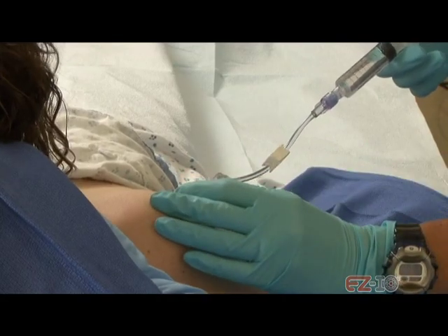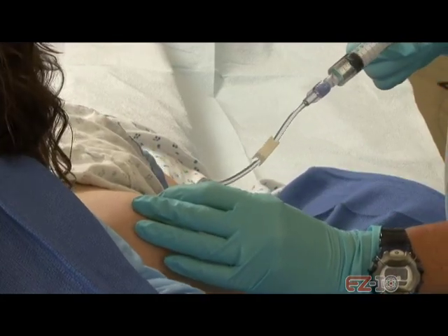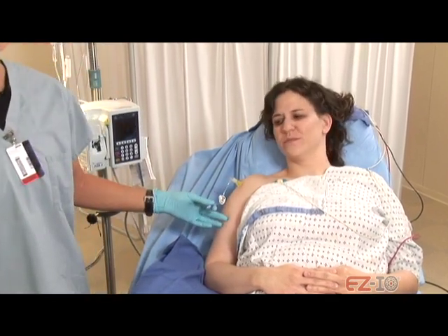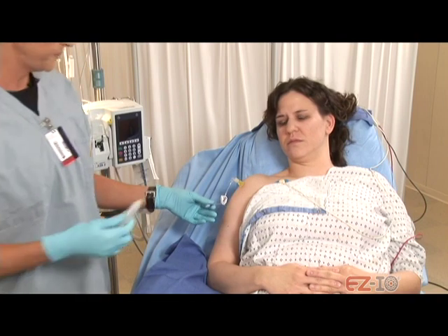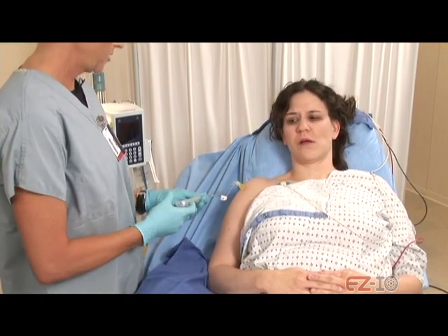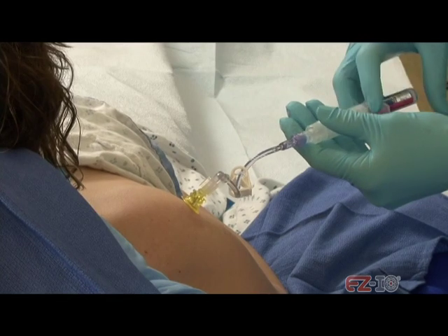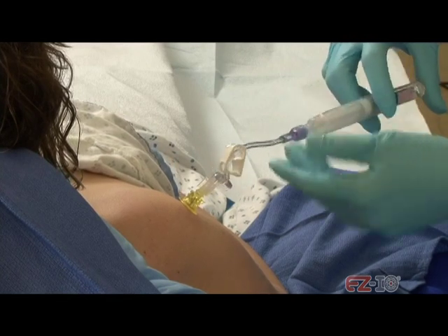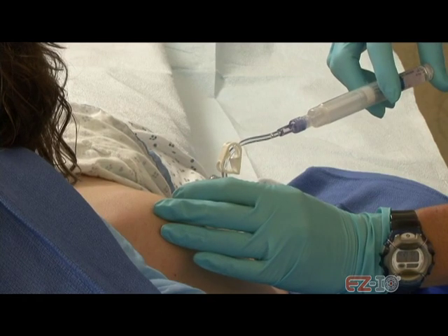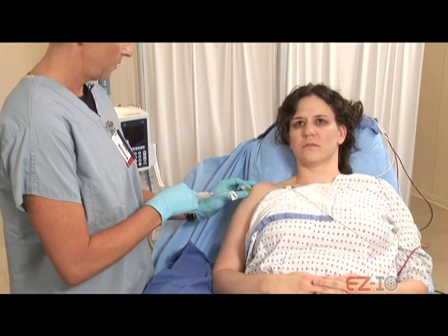Administer 10 milliliters of normal saline very rapidly over 5 seconds or less. Doing all right? Note that the pain will end almost immediately after termination of the flush. Just a little more of that in. Flush is required to get good flow. Remember, no flush, no flow. Consider additional lidocaine following the flush as allowed by institutional policy and procedure.